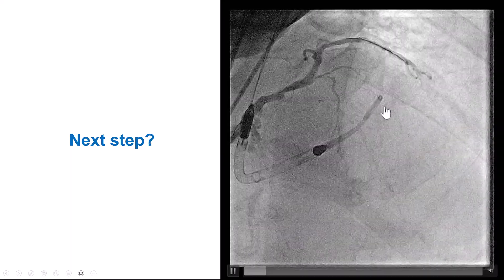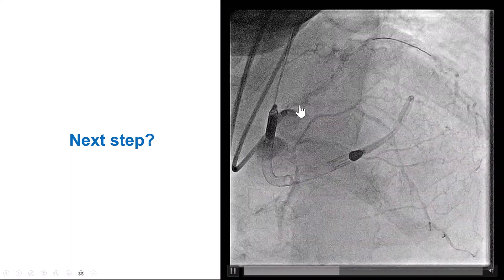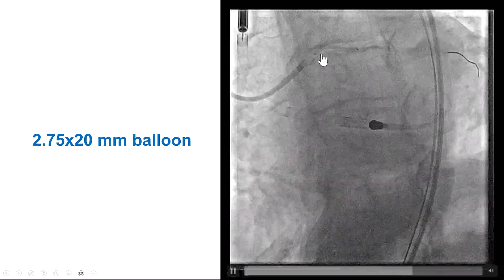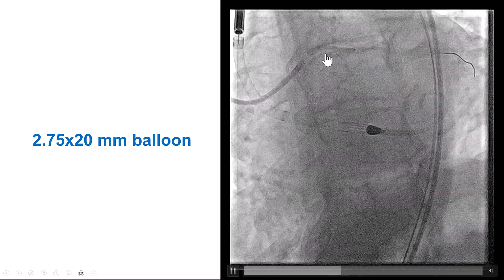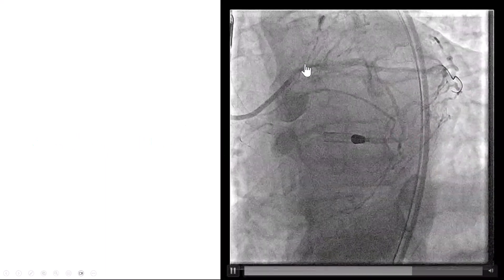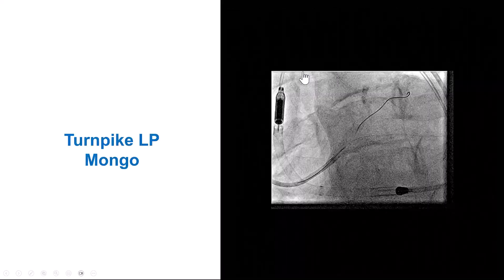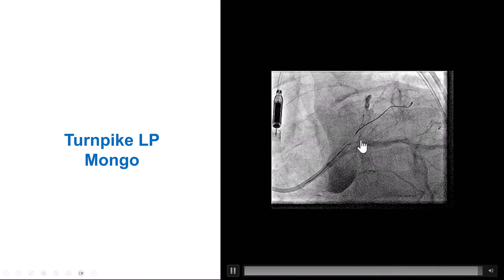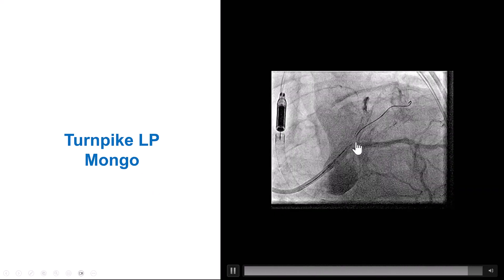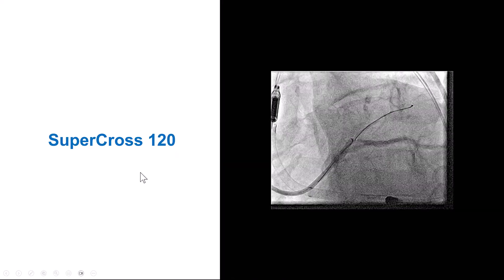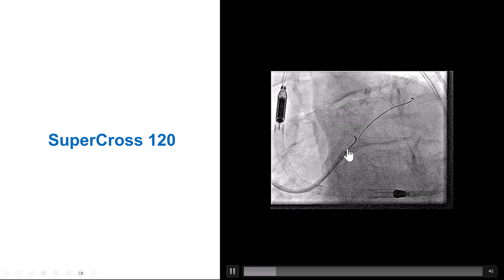There appeared to be a little entry into the occlusion, and we decided to start with antegrade wiring. Because there was significant ostial disease in the circumflex, we did pre-dilation with a 2.75 mm balloon, which improved the stenosis. The patient was stable. We tried to advance a guide wire into the LAD CTO; however, the wire kept going into the Ramus branch and the circumflex — it was very hard to engage this proximal cap. So instead, we placed an angulated microcatheter, a Supercross 120.